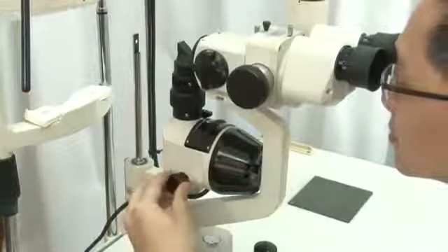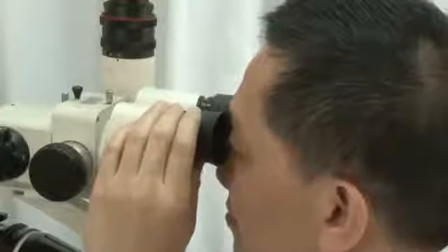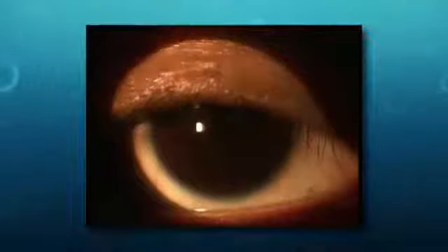Next, view through the other eyepiece. Repeat the same step and note the setting of both eyepieces for future use. Finally, adjust the interpupillary distance of the eyepieces for binocularity and stereopsis.